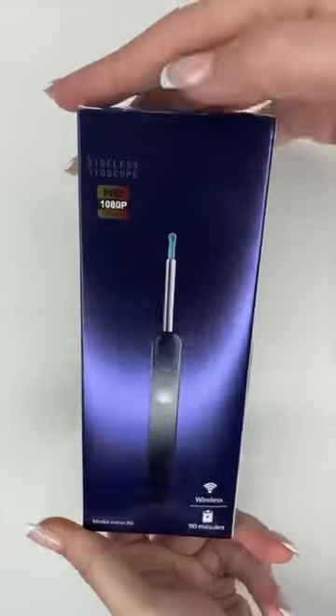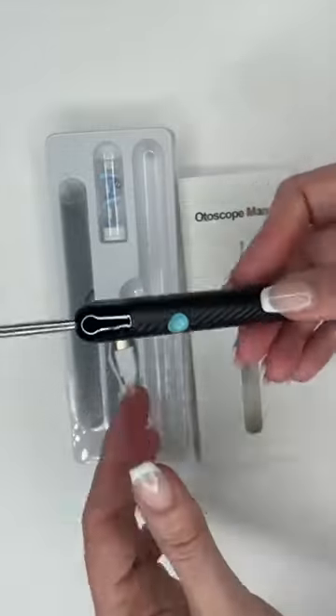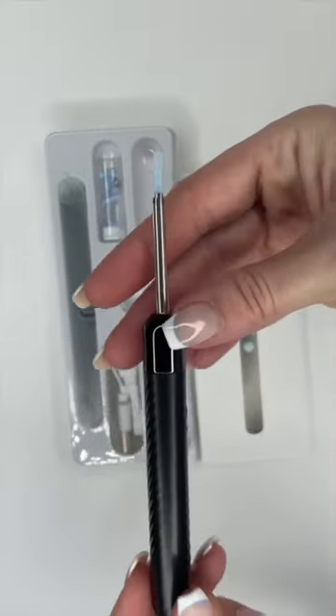Hello, this is Dr. Ronnie Caldwell from The Odd Experience, and today I will be doing a product review of a lighted ear curette that I impulsively purchased from Amazon.